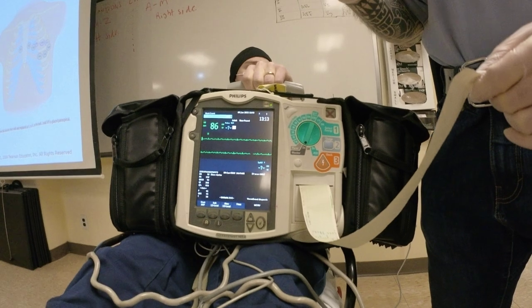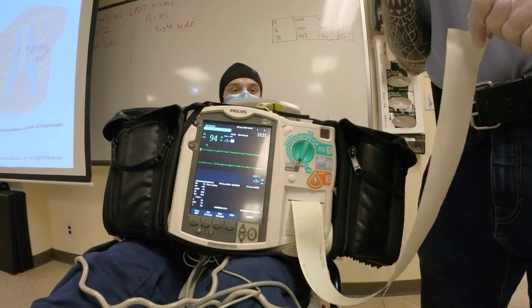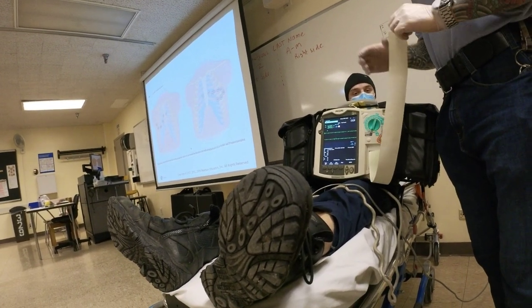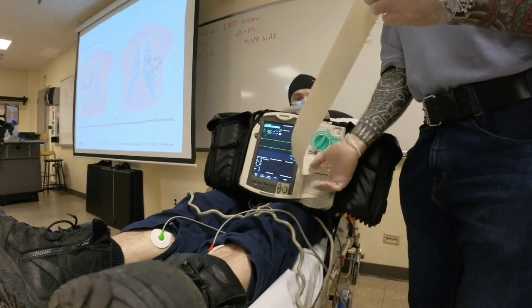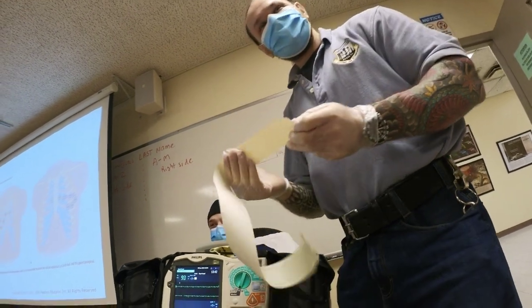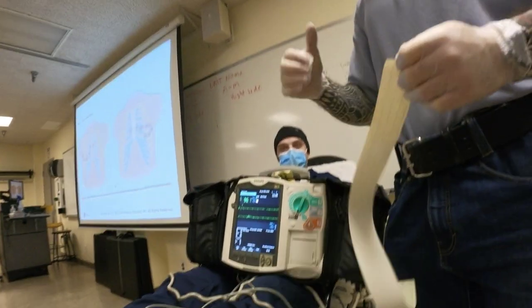For New York City region, if you're working in New York City and your EKG says STEMI and you determine there's a STEMI, you must call medical control before you transport. Anybody know why that's important? If you don't do it, you're going to be restricted. We're absolutely going to take him to the cath lab regardless. But why, in New York City only, do we have to call online medical control? So let's say I take this out. He has elevations in 2, 3, aVF. It says STEMI. I know I have a hospital across the street, and I know they have a cath lab capable facility. I'm going to go. Why should I call anybody?